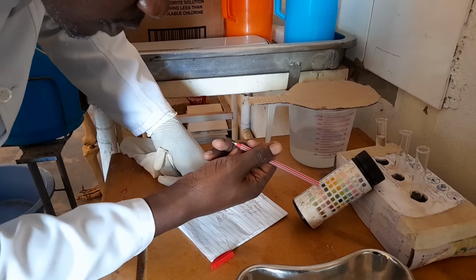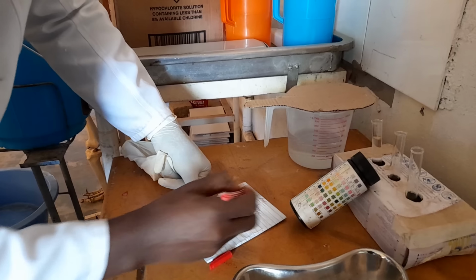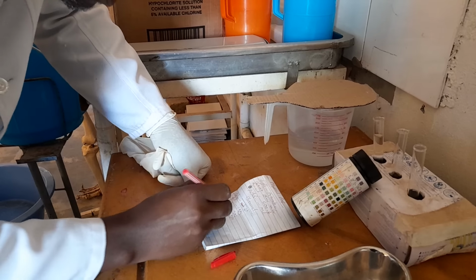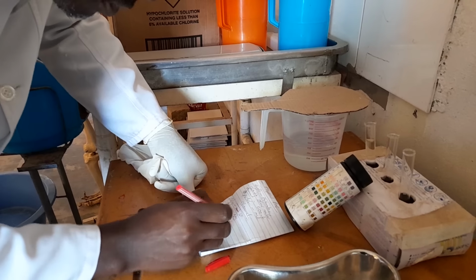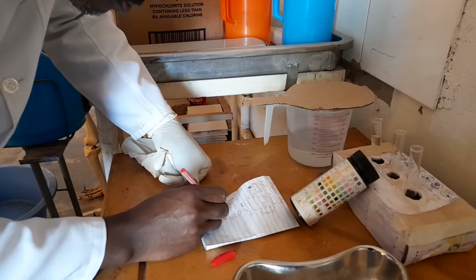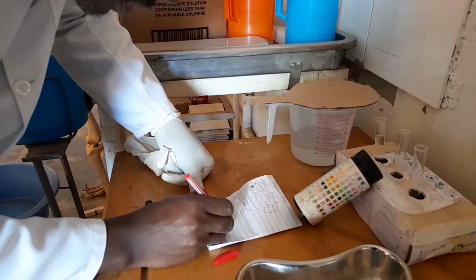Then you go to specific gravity, SG, just write SG. SG was 1030. Then you go to blood, negative. Then if you go to pH, we found that it was 6.0, so indicate 6.0.